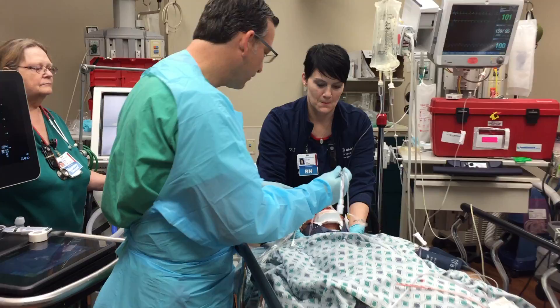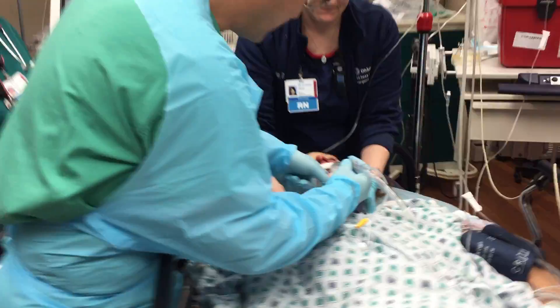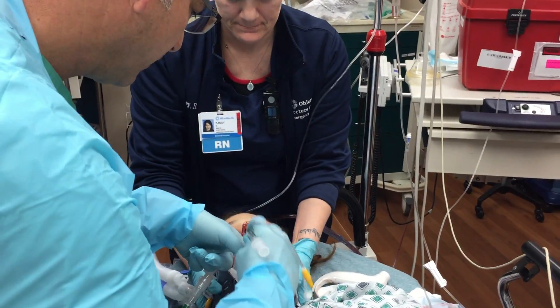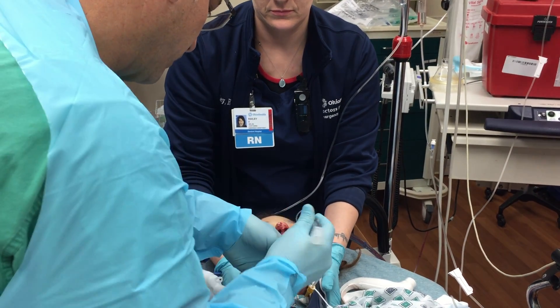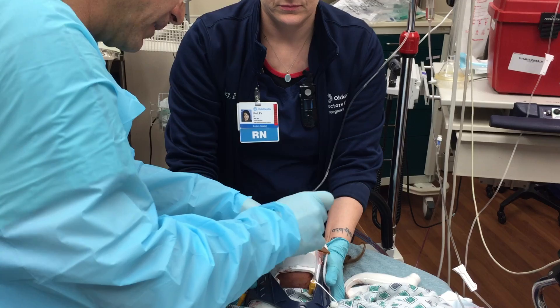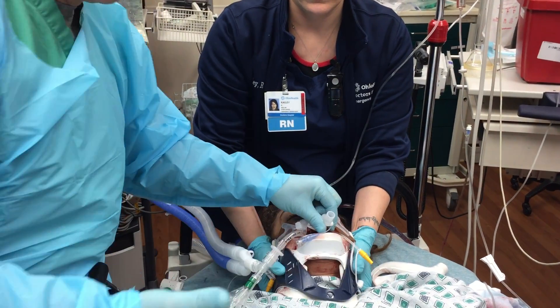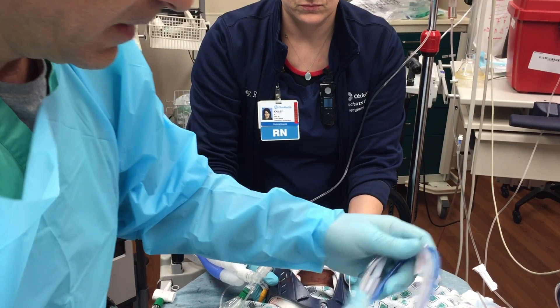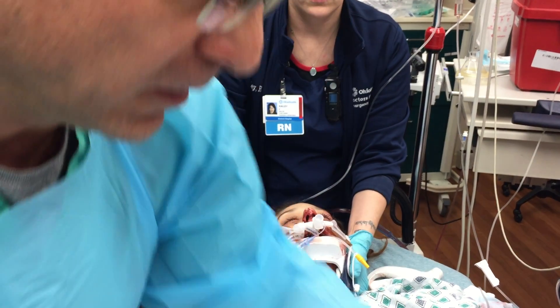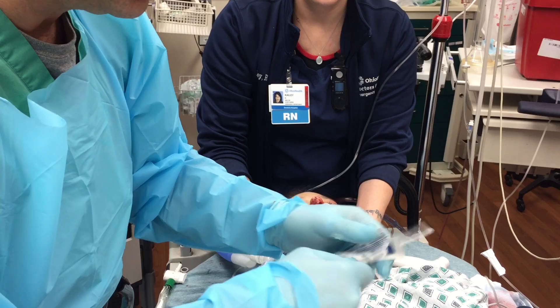I have Kaylee holding the neck for C-spine immobilization. I'm going to take the ET tube — she has a large amount of blood — and easily put it in.